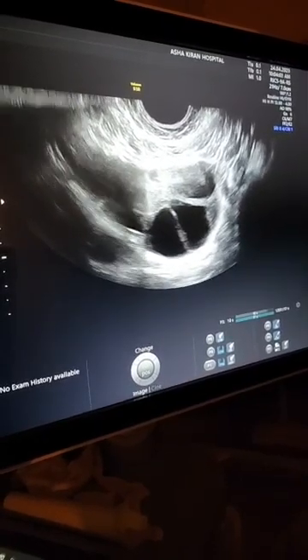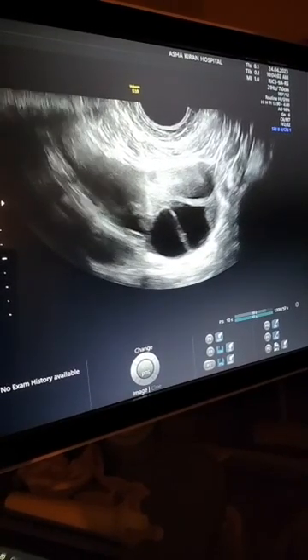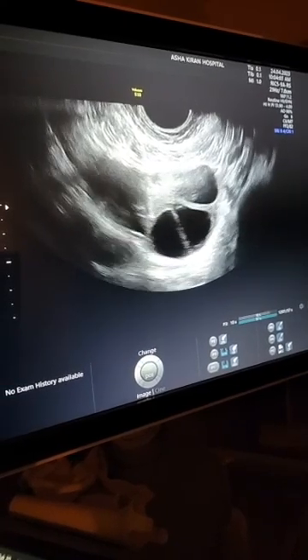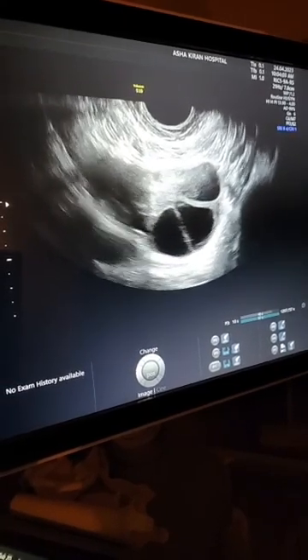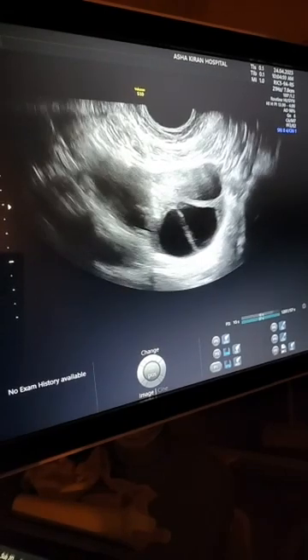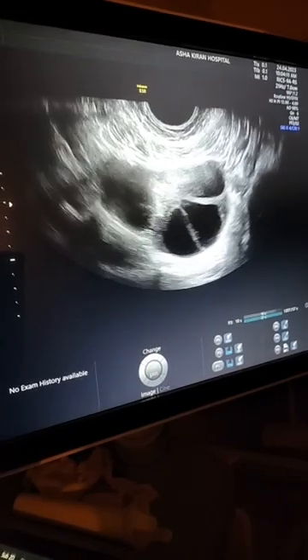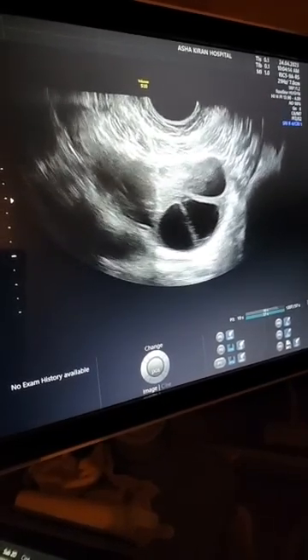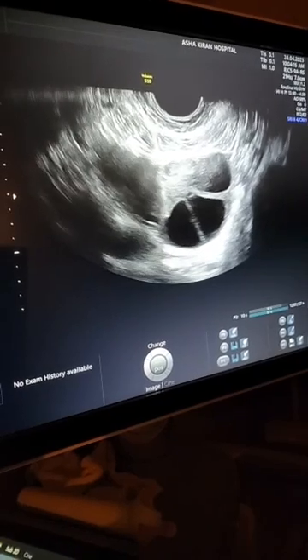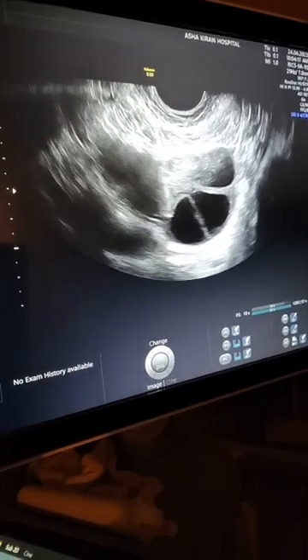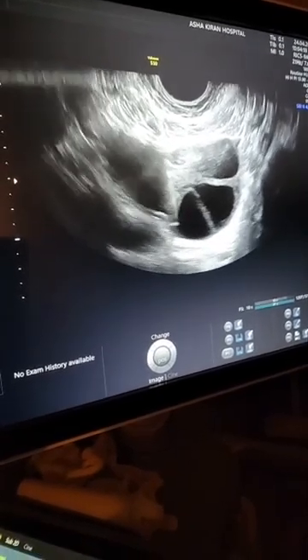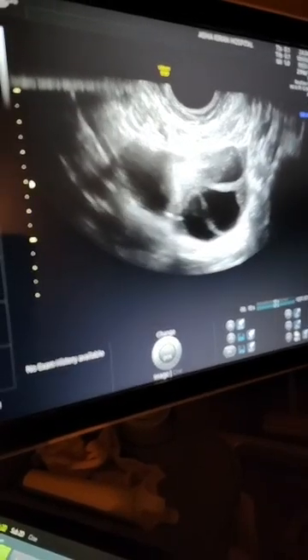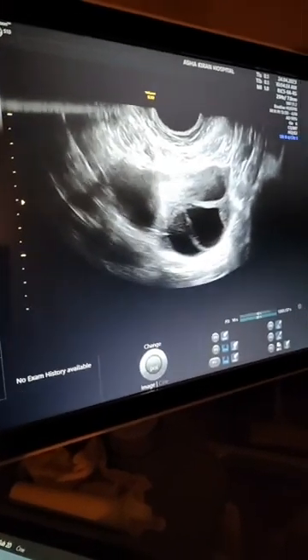My usual team is Dr. Ashwini and Dr. Dinesh who is doing the anesthesia. You can see I will not move — I will just move the needle if at all. I am first taking care of the peripheral follicle.